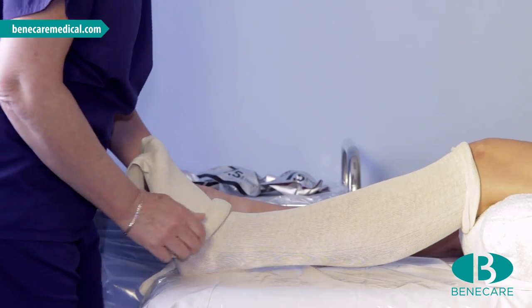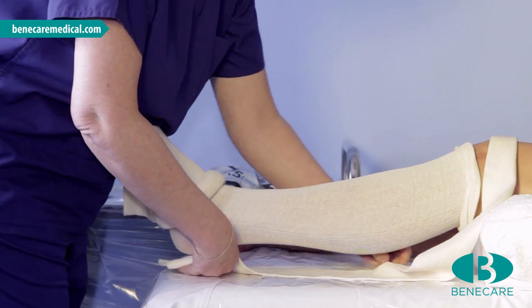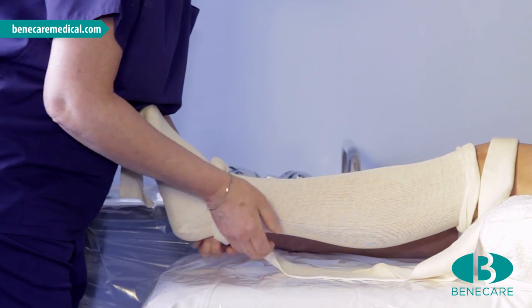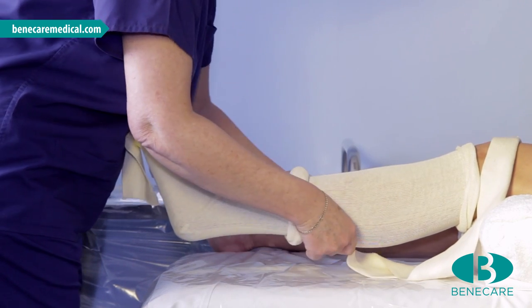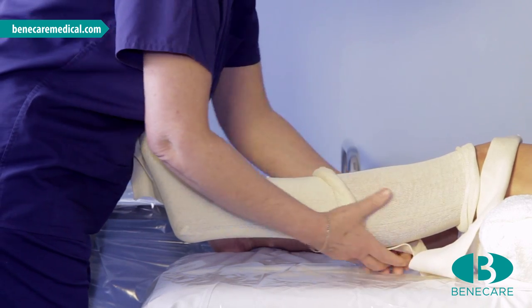Apply a second layer of stockinette as the first, then a third layer that will sit along the posterior aspect of the limb between the two layers of stockinette for protection during removal of the cast. Ensure during each application of stockinette there are no ridges or wrinkles.